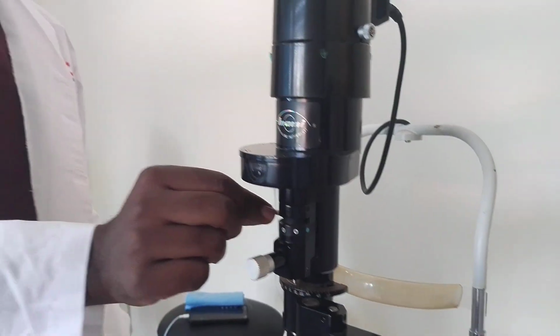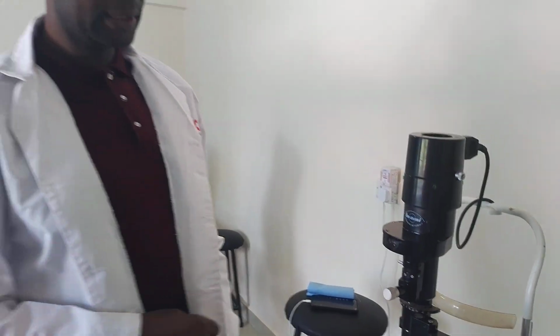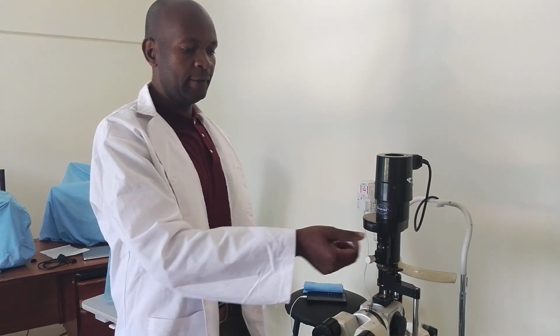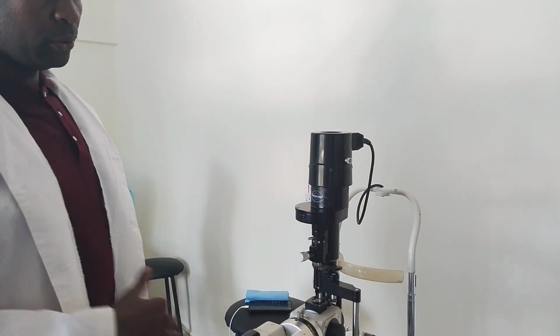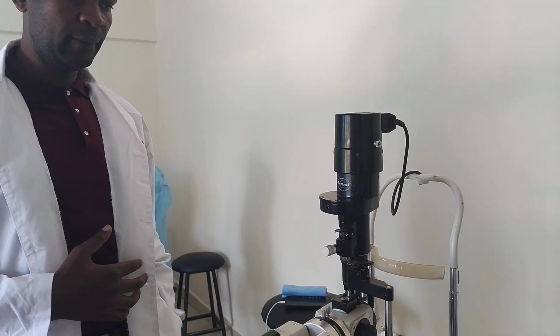For example, we use the cobalt blue filter when we want to examine the cornea of the patient with fluorescent dye, so that we get to see the structures clearly. And we use the neutral filter when we are doing the normal examination of the eye.